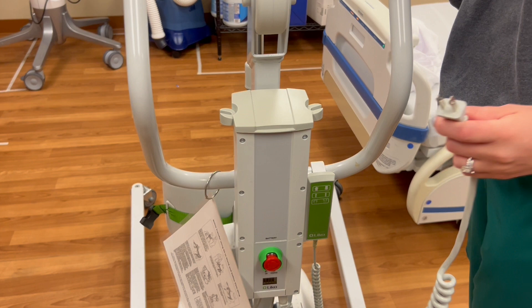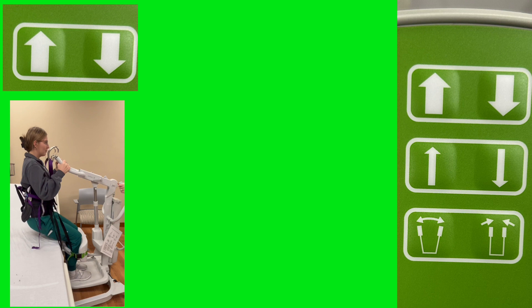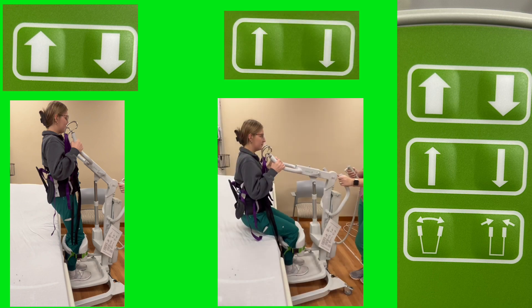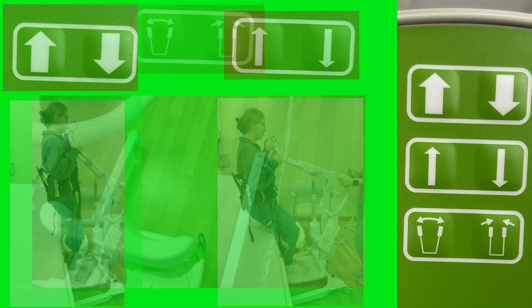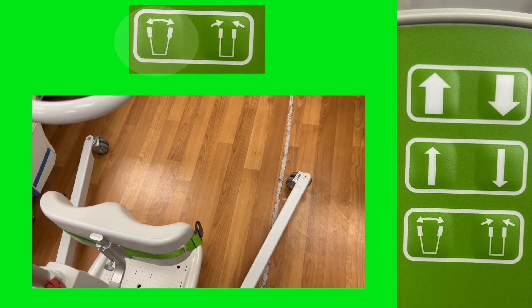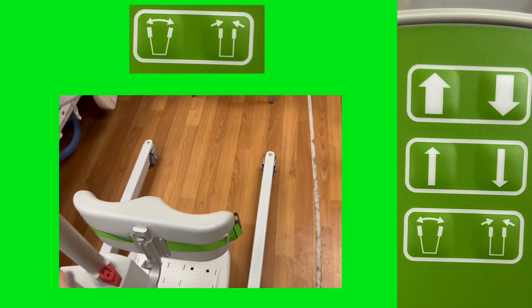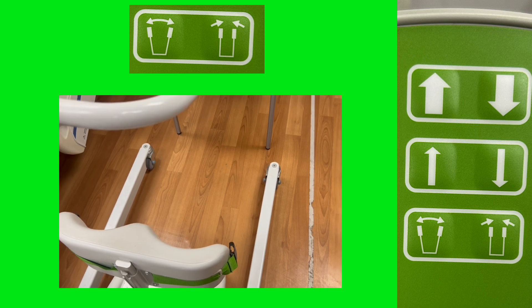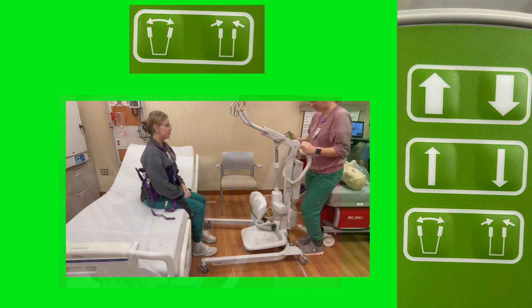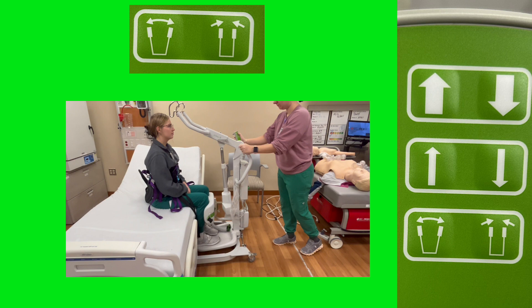The standard electronic controls for the Sabina can be found on the attached hand unit. There are two sets of arrows: the top set are thicker arrows that raise or lower the lift at a faster pace, while the narrower arrows move the lift at half that pace. The bottom set of buttons adjust the width of the lift's feet. The button on the left will widen the feet, and the button on the right will bring them back to parallel. This can be useful when bringing the lift close to the patient or desired destination — you may need to widen the feet to get around the legs of a chair or commode, or bring them together to fit between the legs of a bed.